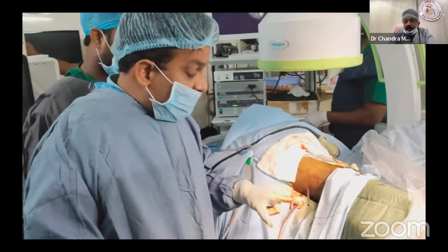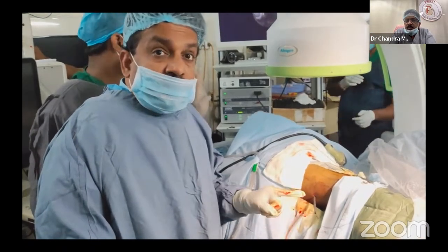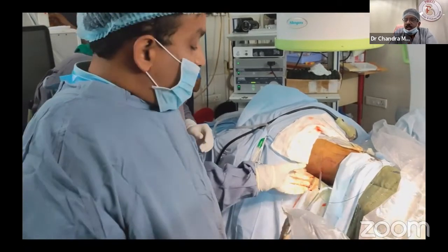In supine PCNL, this guide wire is useful until you enter the system. After that you can take it out because it occupies a lot of space. You should always flow water without air bubbles. Now I am using a 12 French nephroscope through the 15 French access sheath, where water logistics will be perfect and distension of the system will be adequate. Some amount of water will be instilled from the ureteric catheter below, not very much.